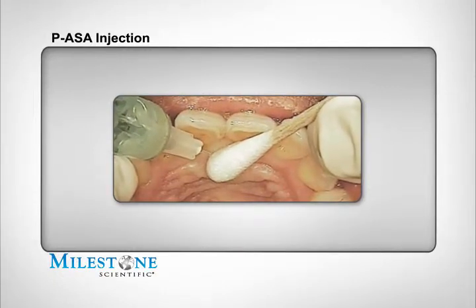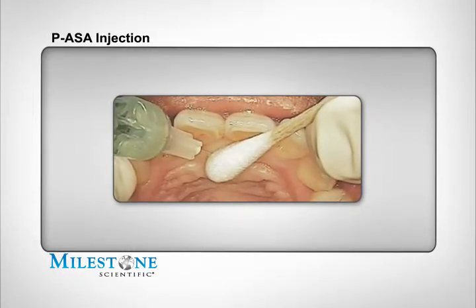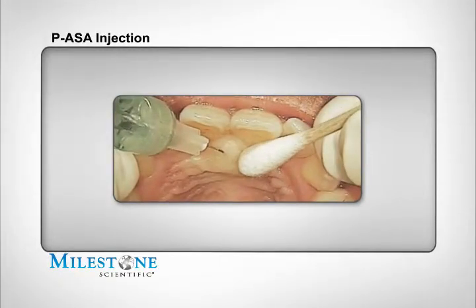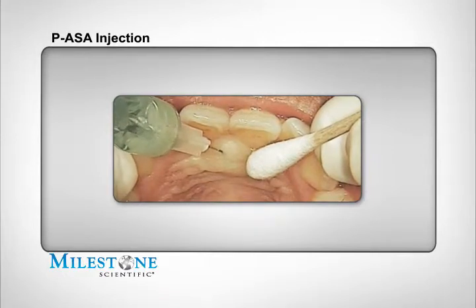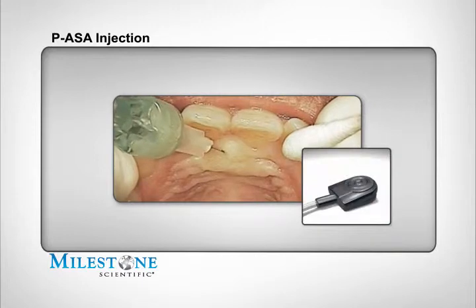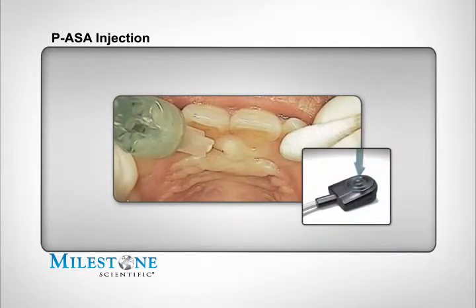All movements must be performed very slowly and gently. Do not move the needle more than 1 to 2 millimeters forward each time. Rapid movements are contraindicated. When the needle is in the canal and contacting the inner bony wall, stop movement and aspirate by depressing and releasing the foot pedal.